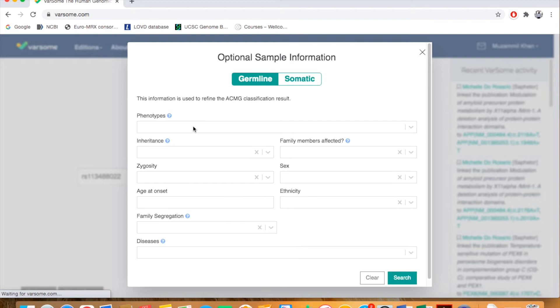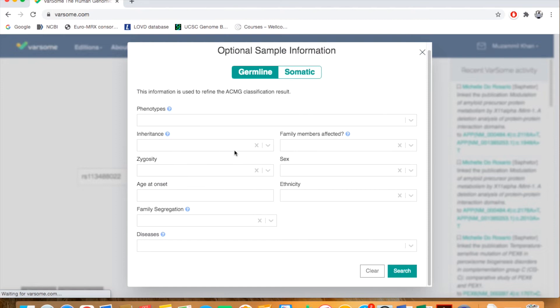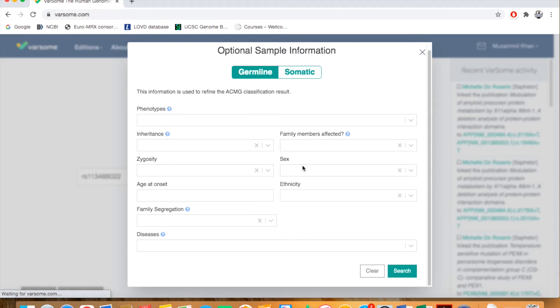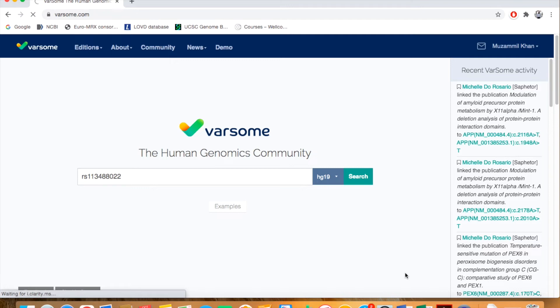For the phenotype presented by the patient, you can give information here: the inheritance spectrum, autosomal dominant or recessive, pedigree information, family history, gender information, zygosity (homozygous or heterozygous), and all these details. You can even go ahead without filling this information because these are optional, nothing is mandatory. Just click on the search option.